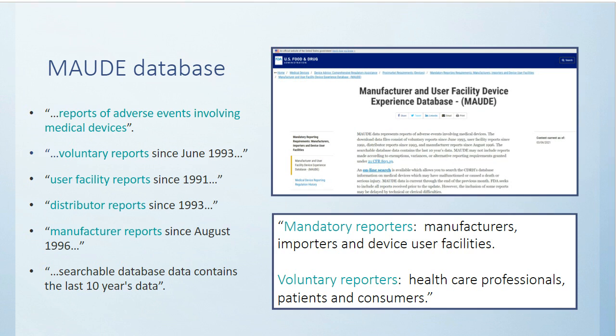It's also voluntary for healthcare professionals, patients, and consumers. And sometimes you do see patients upload their adverse events into this database. So it's got at least the last 10 years worth of data in there. It's a lot. It really is a lot to take in and a lot to get used to when you're looking through it. And again, that supports why we added those citations into the next ST91.